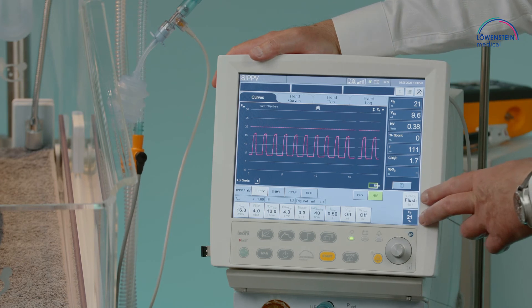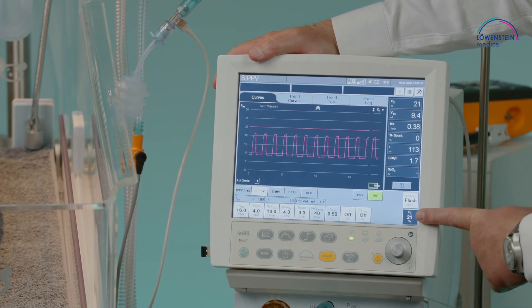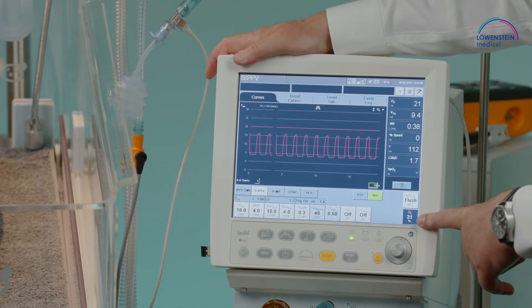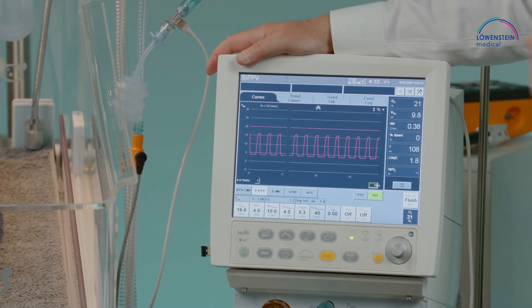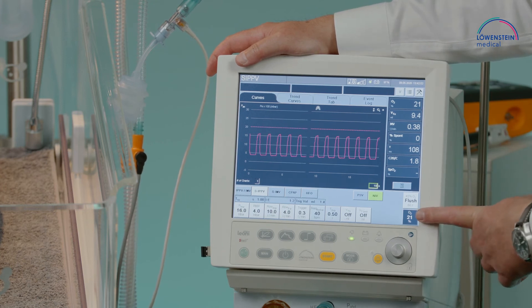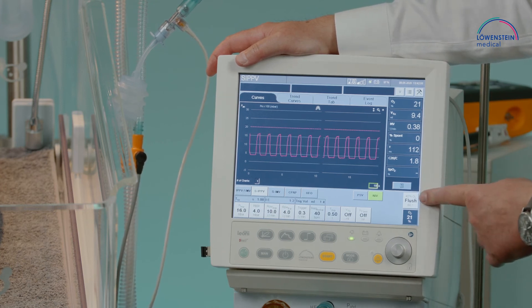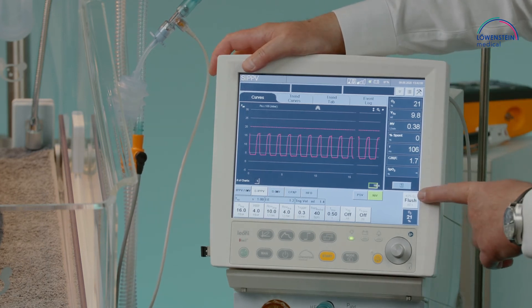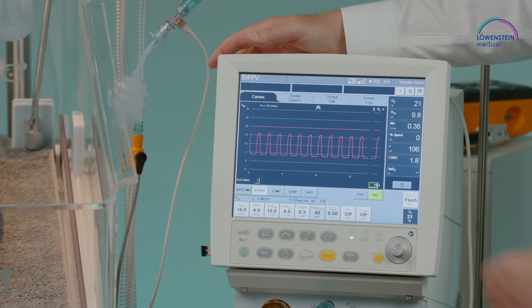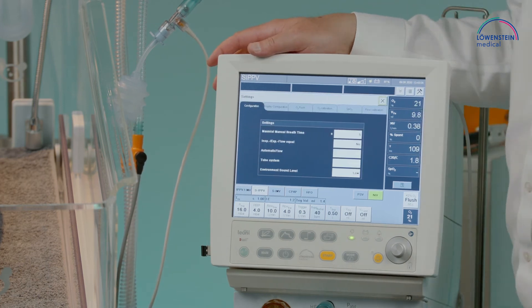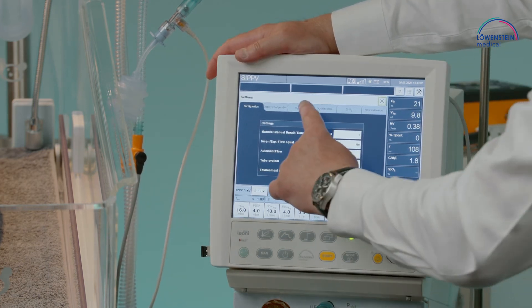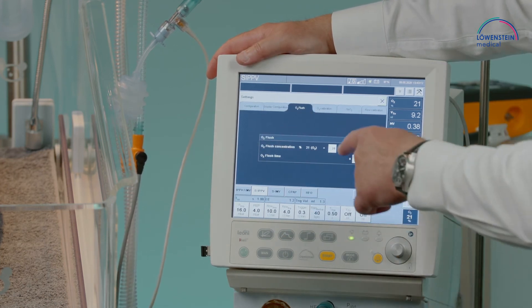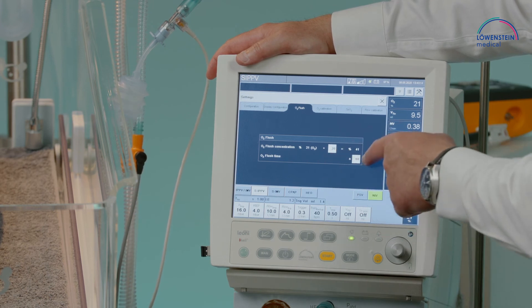The FiO2 adjustment is available as a high-priority control with a distinct color to indicate it is a very important setting. The flush function is also present, giving the opportunity to release a flush to the patient. The flush adjustment also allows us to set the Delta FiO2 as well as the flush time.